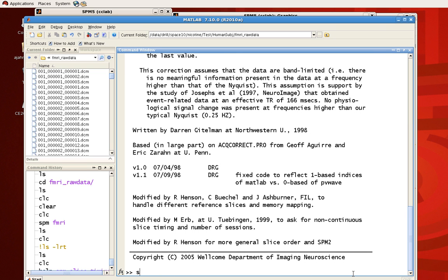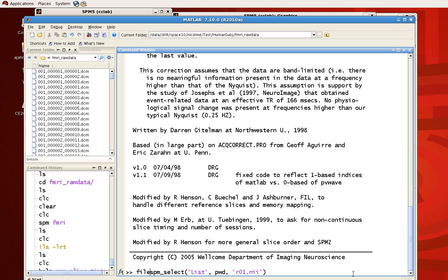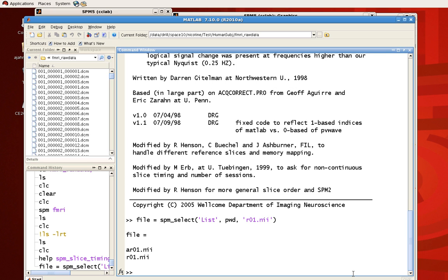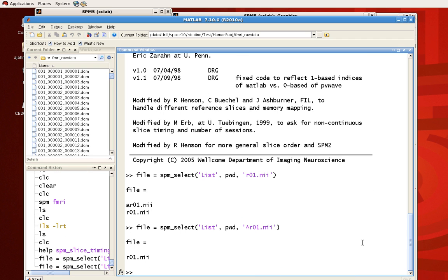So what we can do here is we can use spm_select to only select the image that we want. In this case, we want to just look at r01.nii. This was the dataset that had been converted from the raw data. We can assign it a variable name. So let's say file equals spm_select. Like we talked about in the last tutorial, you can provide a wildcard expression to only select that dataset that starts with r01.nii. This caret means only select a dataset that starts with r01. So file now is r01.nii. Now we have a list of the image that we want to slice time correct.